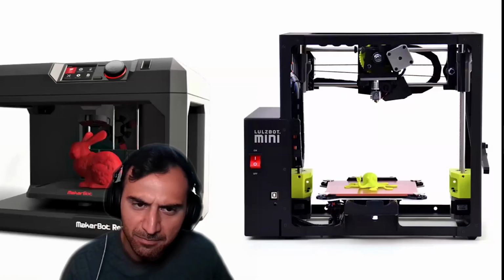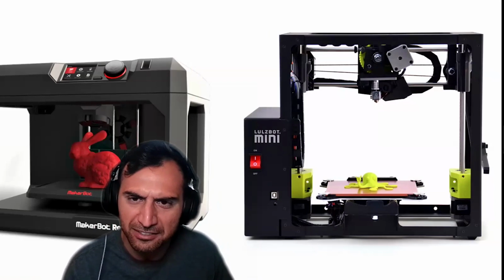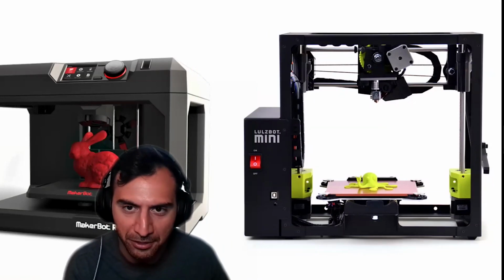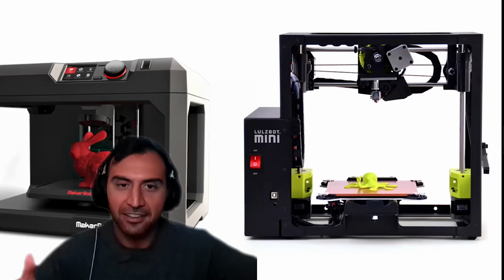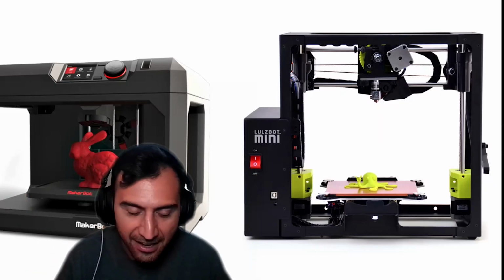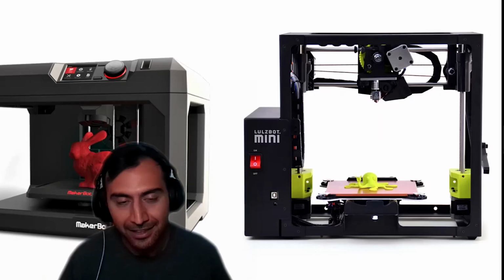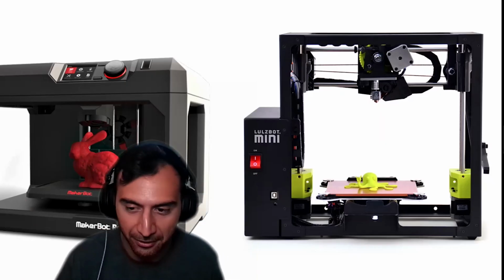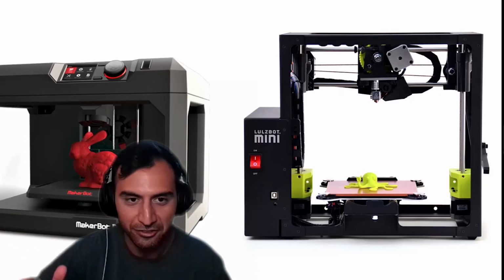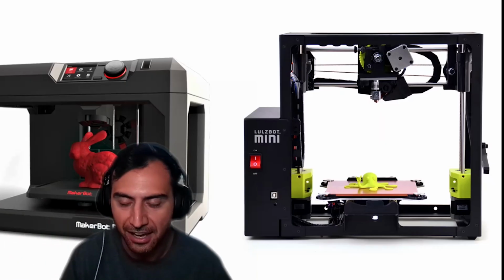But come the turn of the 2000s, late 2000s, probably early 2010, that range of time, we start to get what we call these desktop 3D printers. Basically, 3D printers you can put on your desk, just like it says, or put in your office. They're small enough, so they've got a small footprint. They're cheap enough too. So we're talking $1,000 or less instead of $300,000. And that's just $300,000 in 1980s money, not today's money. I'm sure it's like $1 million at this stage. But these printers around 2010 are less than $1,000.